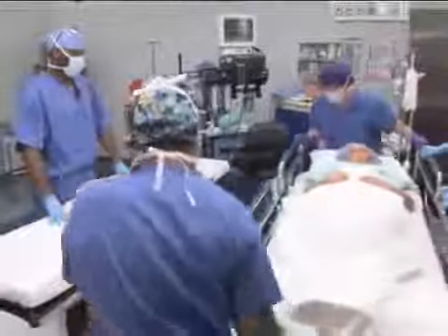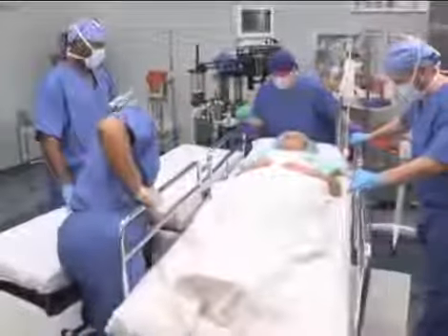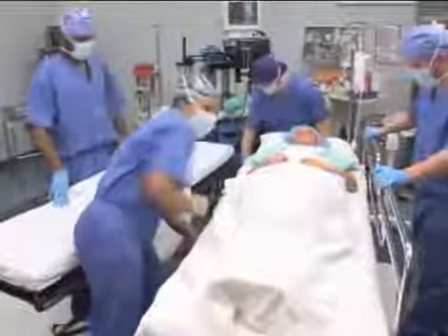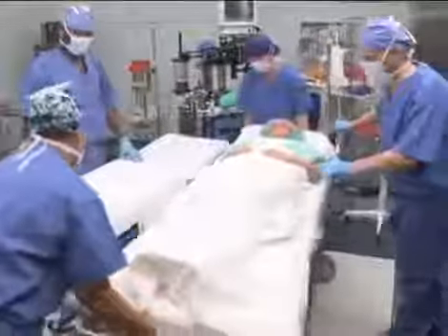To transfer a patient from a stretcher to an operating table while the patient is conscious, at least 4 people are required, and careful technique must be observed to avoid injury. Align the stretcher with the operating table and make sure the wheels are locked on both the stretcher and the table. Never move a patient onto an operating table with wheels that do not lock. The patient may fall to the floor between the stretcher and the table.